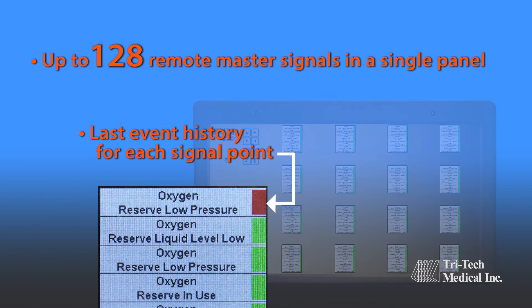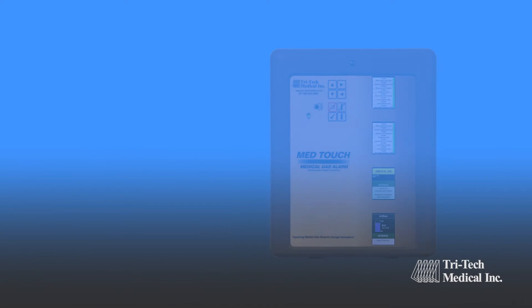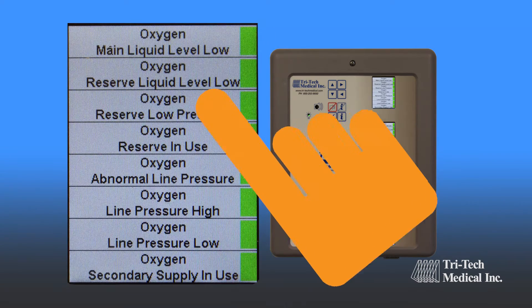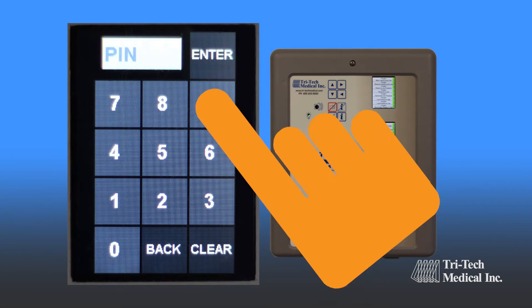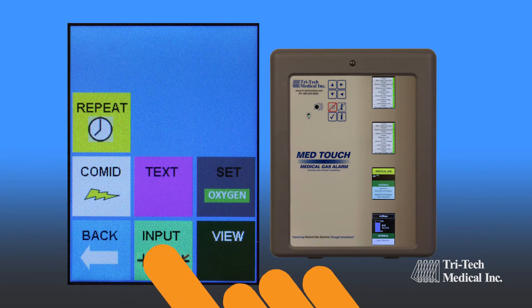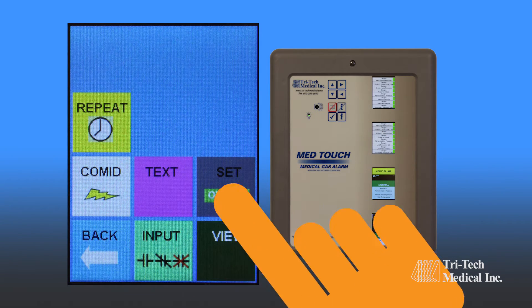Last event history is provided for each signal point. Self-diagnostic error messages are displayed for ease of maintenance, with simplified programming through simple icon and question and answer choices.